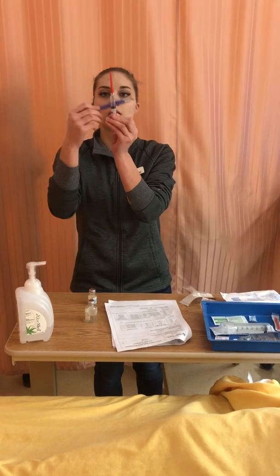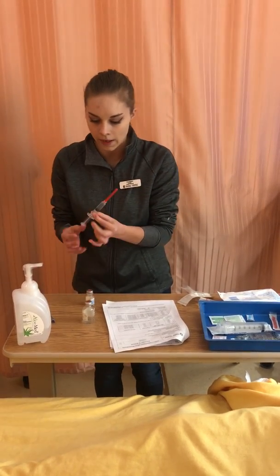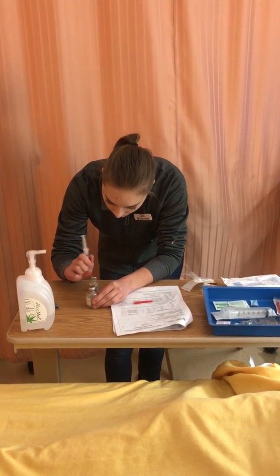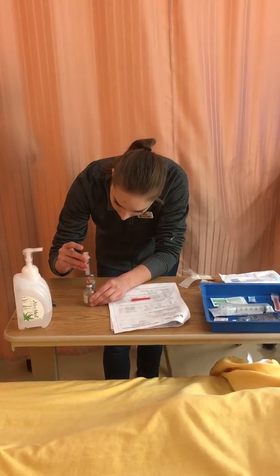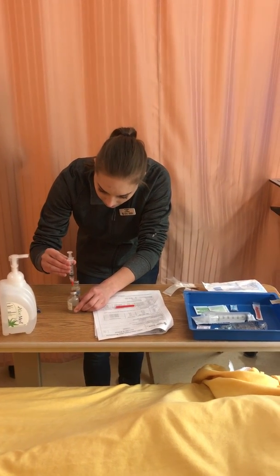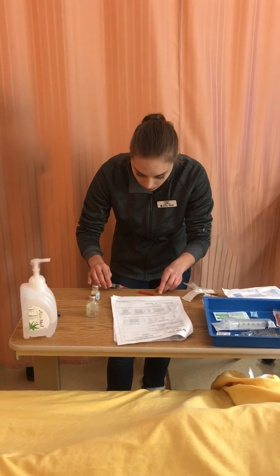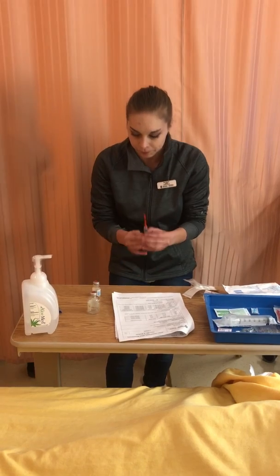Making sure I have no bubbles. And now I can inject this into my medication to reconstitute. And then I'm going to let any air come up, just so that I'm making sure that I'm getting the full medication when I do go to withdraw. I'll take that out. Recap my needle because I'm using it again.